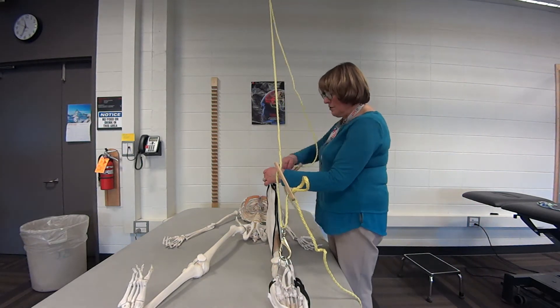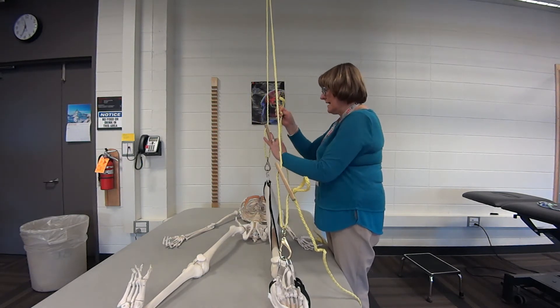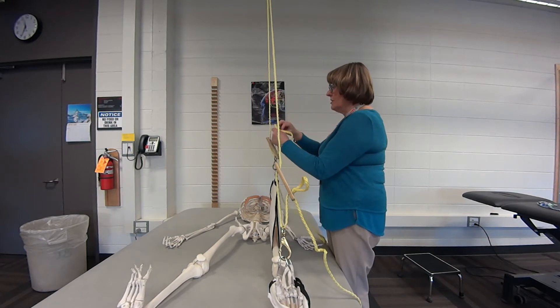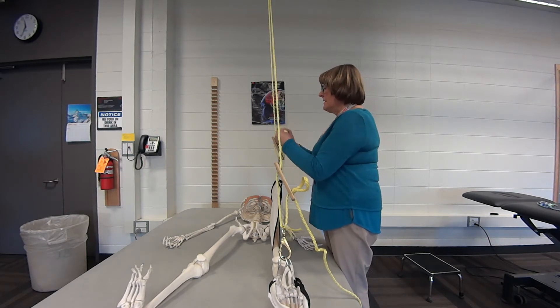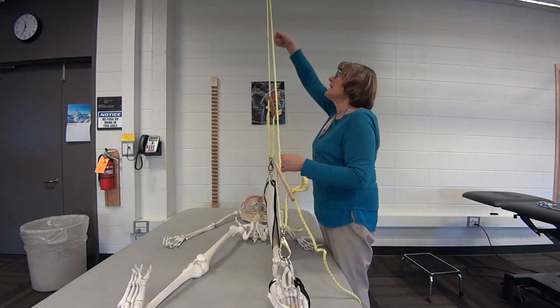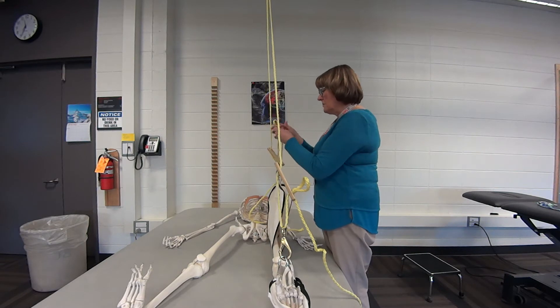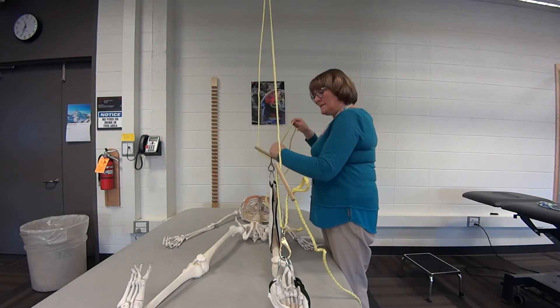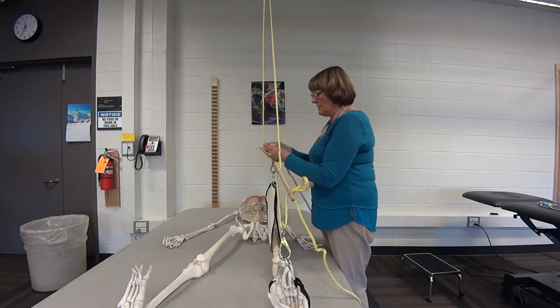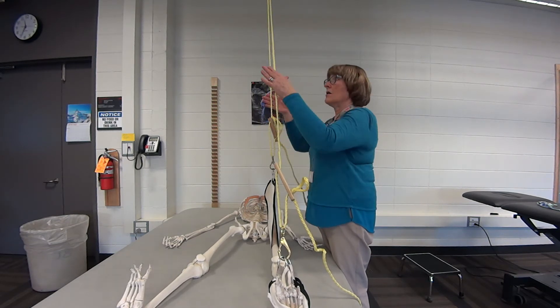Then put on the thigh sling. Again, take up the slack. You want to put your knot close to the bottom — if the knot is way up high, when you lift it you'd be working above shoulder height, which is hard. Always make sure it's low enough to be easy to work with.